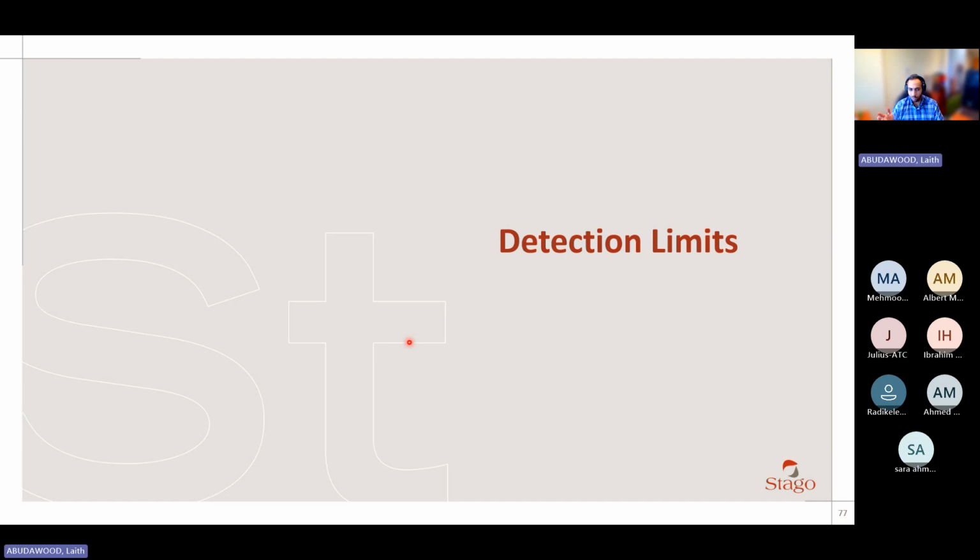For people who are not familiar with transference: I have another lab that has basically the same analyzer I have and the same population that I have. They have established their own ranges. So I'll tell them, please give me your ranges, because it's the same reagent, the same analyzer, the same population. They have done the establishment already. I will take this range and try to verify it with my own population.